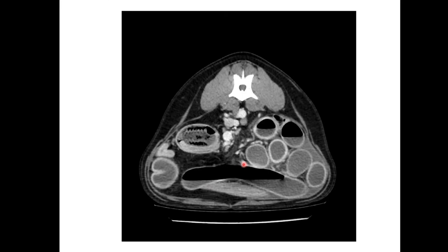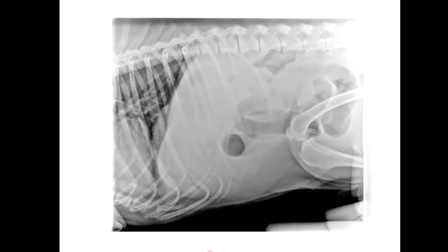Could it be a corn on the cob? Absolutely. This is absolutely a corn on the cob. It has this really characteristic appearance where you've got these corrugated margins surrounded by gas — that is absolutely pathognomonic for a corn on the cob. This doggy has eaten a corn on the cob, has a foreign body and a mechanical ileus, and absolutely needs to be cut and have it taken out. Now, having looked at the CT and using the retrospective scope, I think it might be quite fun to go back and look at the radiograph again, now that we know this dog has a corn on the cob in it.